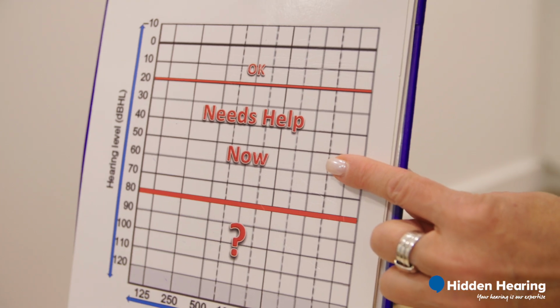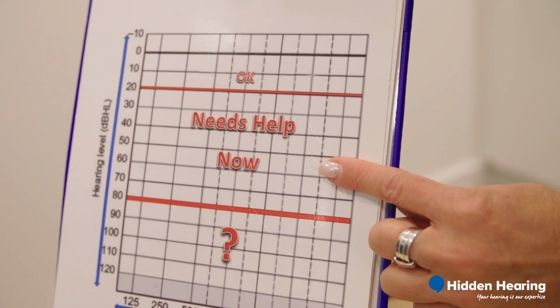At the end of the test, we go through what we call an audiogram. We tell them exactly where the hearing test result is plotted on that audiogram. We tell them you have an okay hearing, you need help, or your hearing is at a level that we need to take extra care and see how we can help the patient.